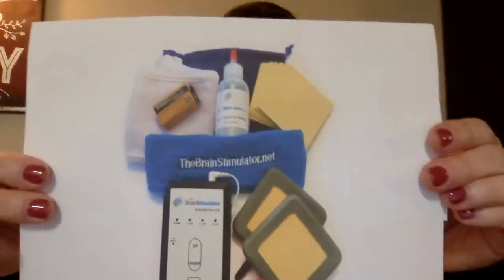So to give you a little bit more of a visual regarding what all of this means, the materials you will need for this treatment look like this. For this particular example, I went off of one company's device and device kit. So it's the brain stimulator. There are multiple devices that you can buy from, but this is everything that you're going to need for tDCS.